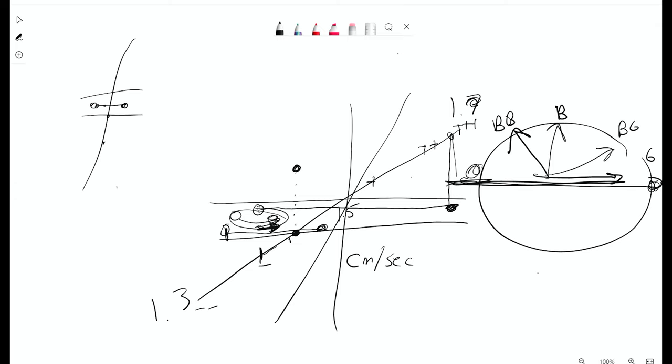And so there are techniques that involve an SSFP readout, and there's non-contrast renals, for instance, where there are inferior sat bands trying to keep the venous signal from showing up, and you're waiting, it's like a time of flight, but with a readout of the SSFP sequence. I've got to hand it to Toshiba and Hitachi on that one, because in the Asian market, they don't give a lot of contrast. And so those vendors are very far ahead when it comes to non-contrast MRA techniques. But the non-contrast is always centered around some sort of gating, some sort of saturation of background tissue, venous or whatever, and then a readout of the SSFP sequence.